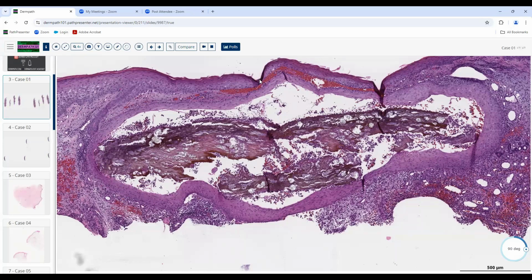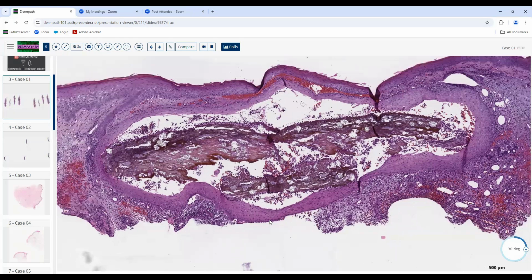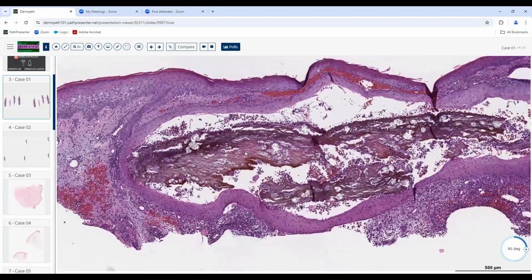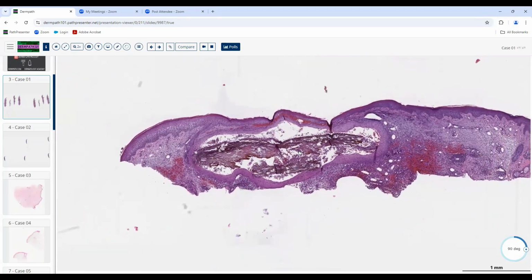It's this little sinus tract, little cyst that's kind of formed around this, and it's trying to transepidermally eliminate it. And so it formed this little cyst, and the clinician probably thought it was a cancer. It might have looked kind of blackish or brown. They might have thought it was a melanoma, for example, or a pigmented basal cell carcinoma. But anyway, it's kind of a nice teaching case because it's got that fungus that's not really pathogenic.